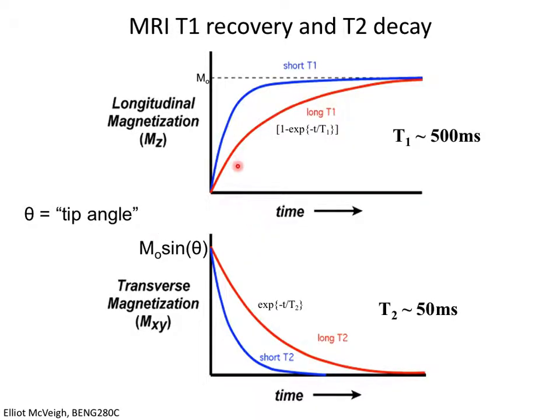We also looked at T1, which is the rate at which the magnetization vector recovers in the longitudinal direction, or back in the Z direction. So recall when I have a sample of a patient or a bottle of water or something, I put it in the magnet. Over the course of a couple of seconds, I will generate a magnetization vector in the Z direction, or in the longitudinal direction.